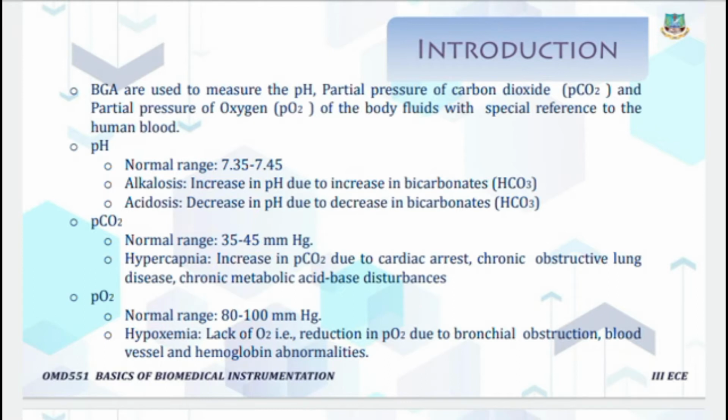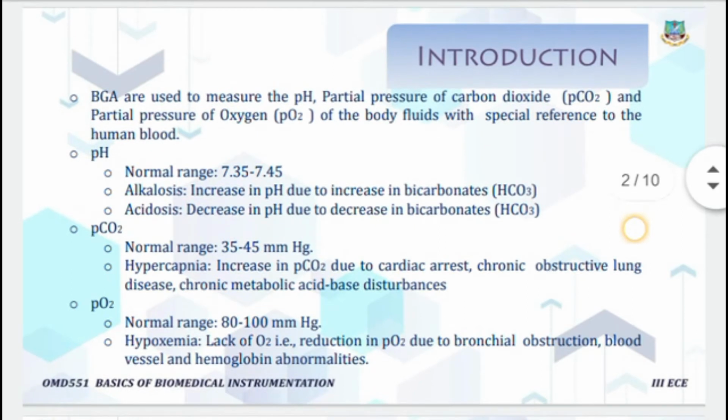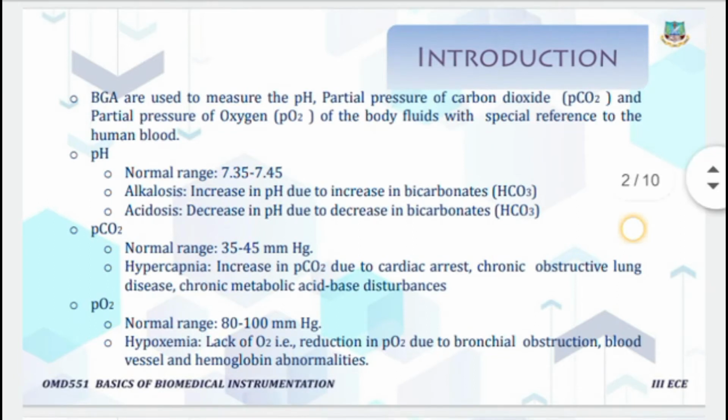Then PCO2. What is PCO2? Partial pressure of carbon dioxide. The normal range of partial pressure of carbon dioxide is 35 to 45 mmHg.